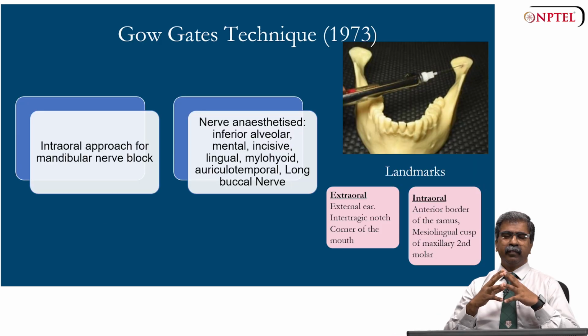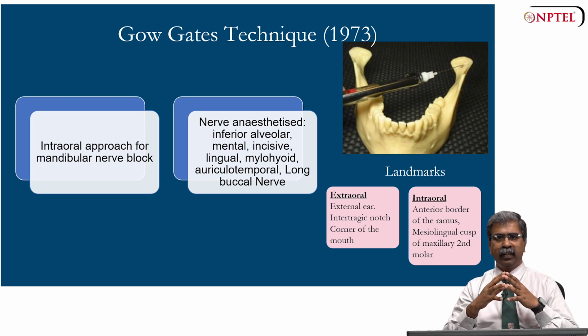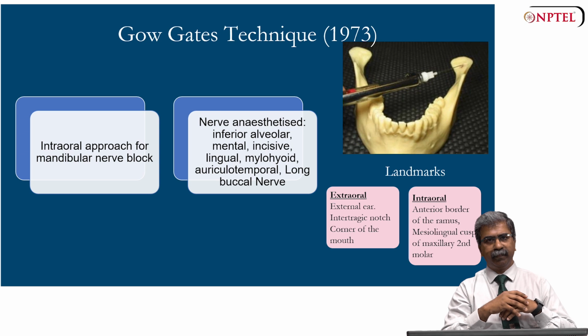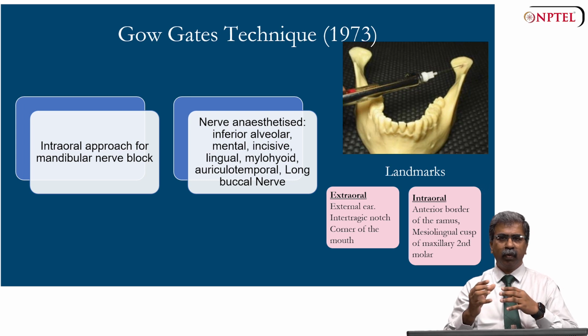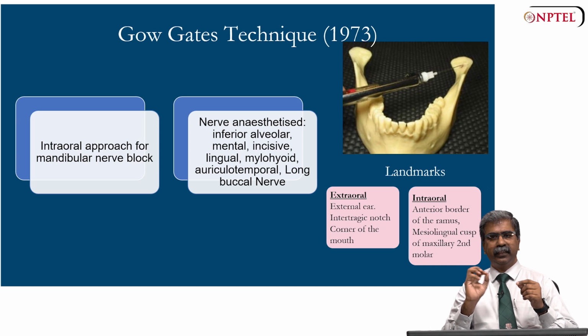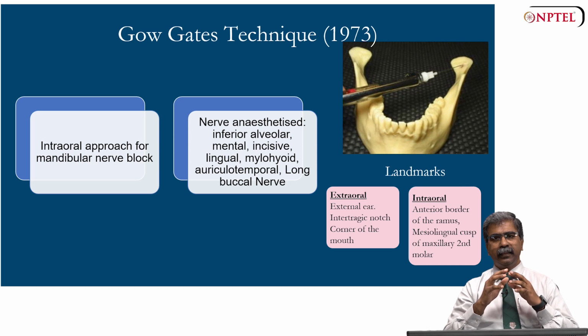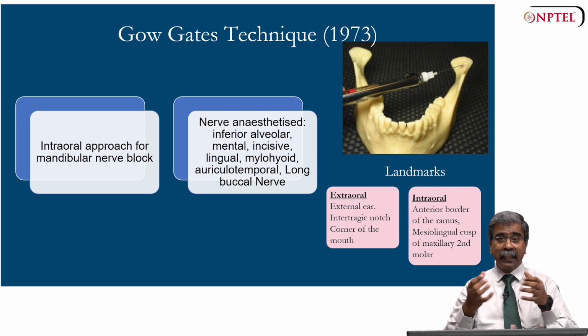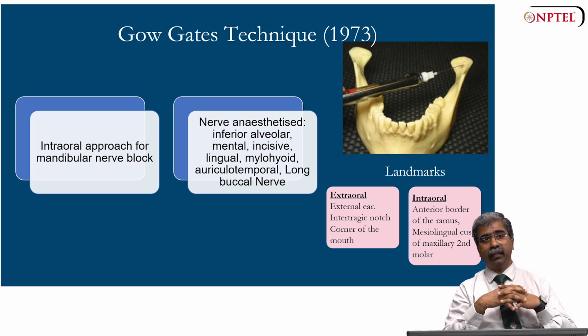positioning. A very, very important technique to anesthetize the inferior alveolar nerve is the Gow-Gates technique. When your conventional inferior alveolar nerve block anesthesia does not work, or if there are any anatomic variations, use this technique, which will be very, very successful. And the technique is also very simple. I won't call it simple, rather comparatively easy. And it is again an intraoral approach for the mandibular nerve.